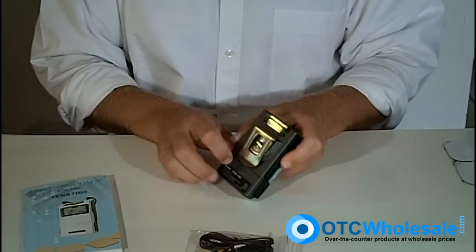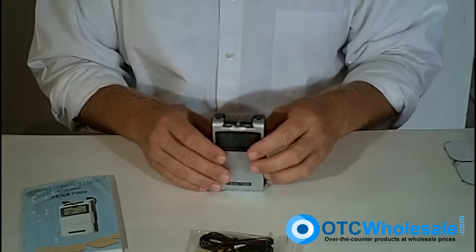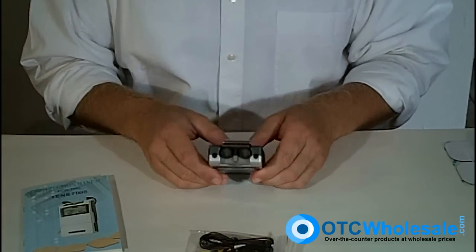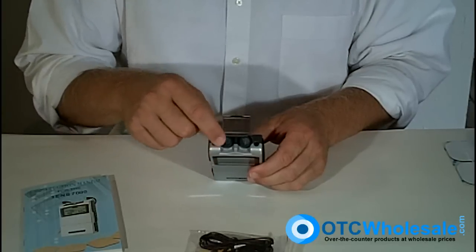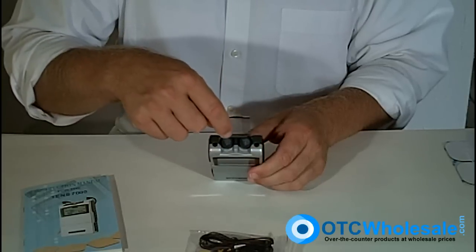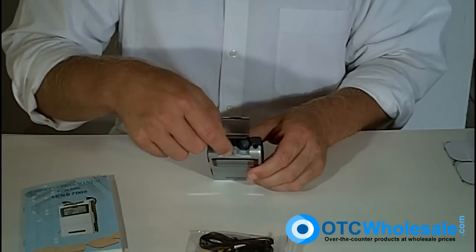You can see the belt hook. Right at the top, if I open up this little translucent plastic cover, I have channel one and channel two, and an intensity knob for each one going from zero to nine.